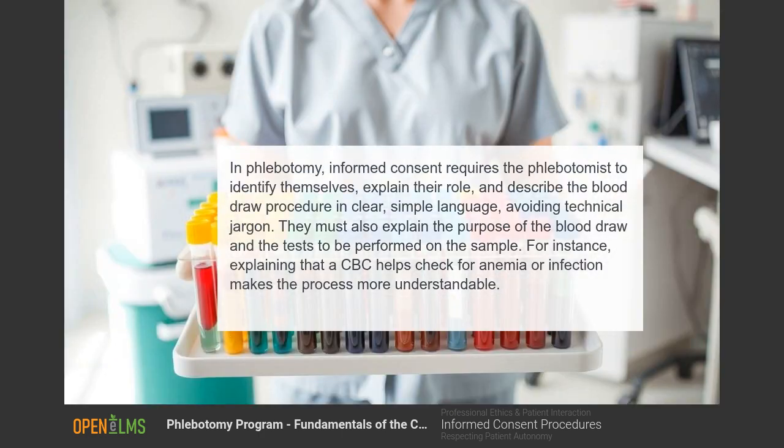In phlebotomy, informed consent requires the phlebotomist to identify themselves, explain their role, and describe the blood draw procedure in clear, simple language, avoiding technical jargon. They must also explain the purpose of the blood draw and the tests to be performed on the sample.